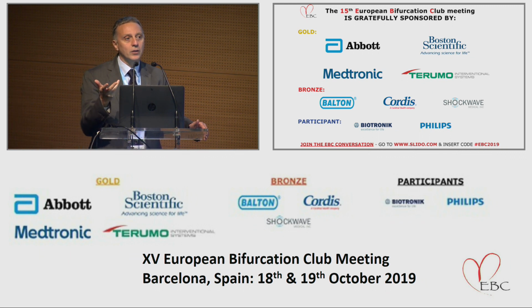As soon as you enter inside the interaction with the machine, you may really look at it with the perspective you like more. For sure, it is possible to do like you anticipated. Sometimes you miss the deepest part of the side branch. There is the problem of penetration of the optical probe. So sometimes when you have big side branches, you have shadow at the end. So you just see the true ostium, and then you do not get the profundity.